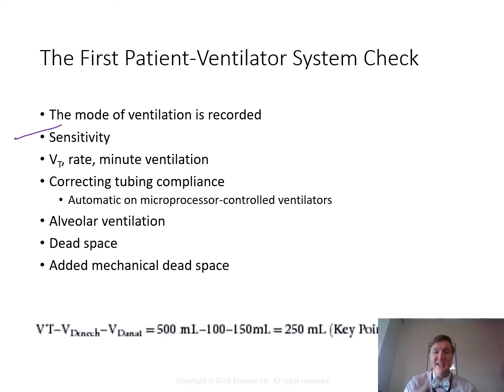So I can go from a CMV to an IMV mode, right? SIMV, or I could go to spontaneous mode if it's appropriate. But it's important to recognize that we might not always be able to eliminate things like auto PEEP. It might still be there, especially with patients that have high airway resistance and high airway closure, right? We're going to have to understand we might have some just there at baseline. It's not that you can get rid of all of it just with your vent setting changes.